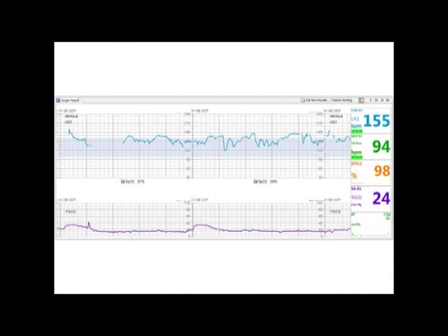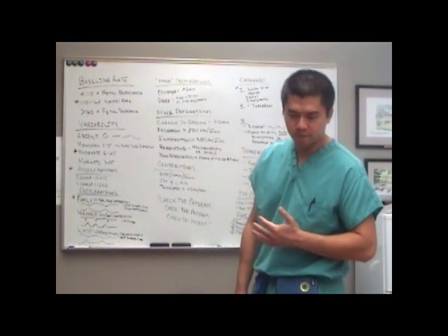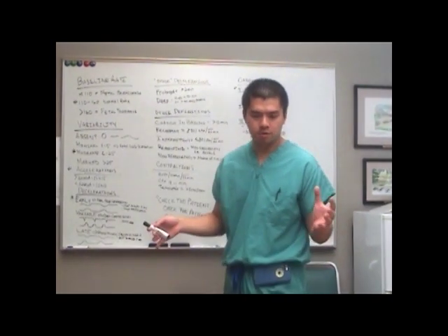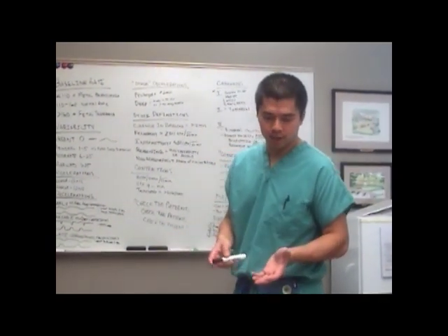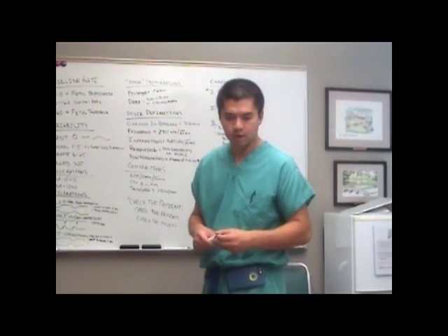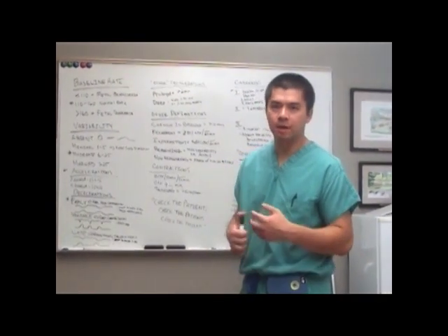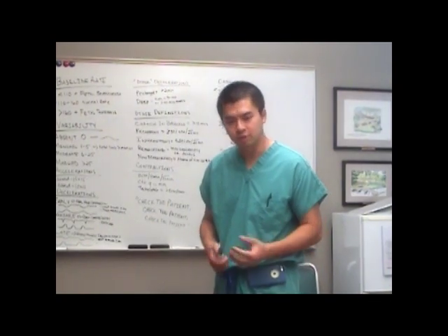This is an example of a shoulder, which sometimes you'll get into some debates or a little bit of confusion in terms of dips in the fetal heart tracing coming off of an acceleration shoulder, or a rise in the heart rate coming off of a deceleration. And to be honest, I don't know the right answer to this, and I don't think there is a right answer, or at least not in the guidelines, in terms of whether or not a short decel after the shoulder of an acceleration is really a variable or a late. Some people will say they don't count as deceleration, some people will say they do.